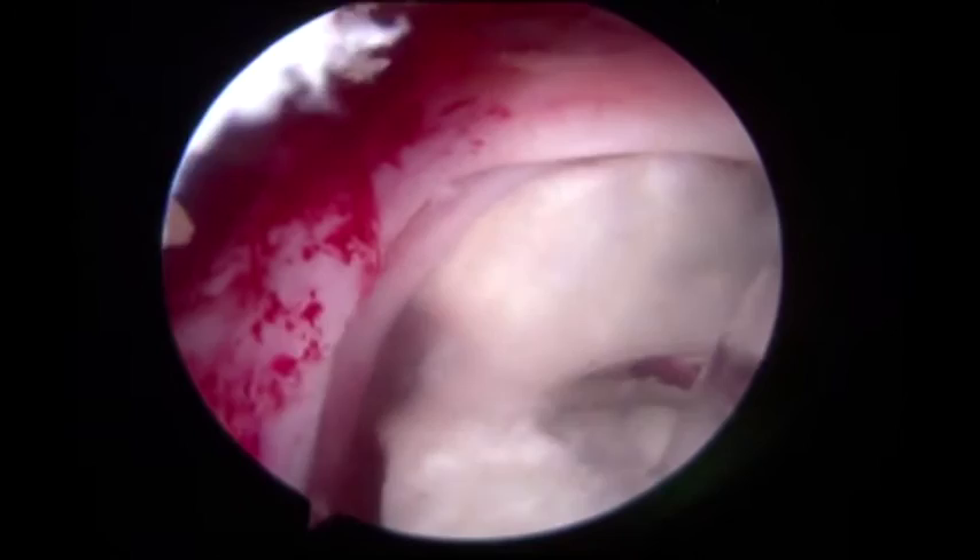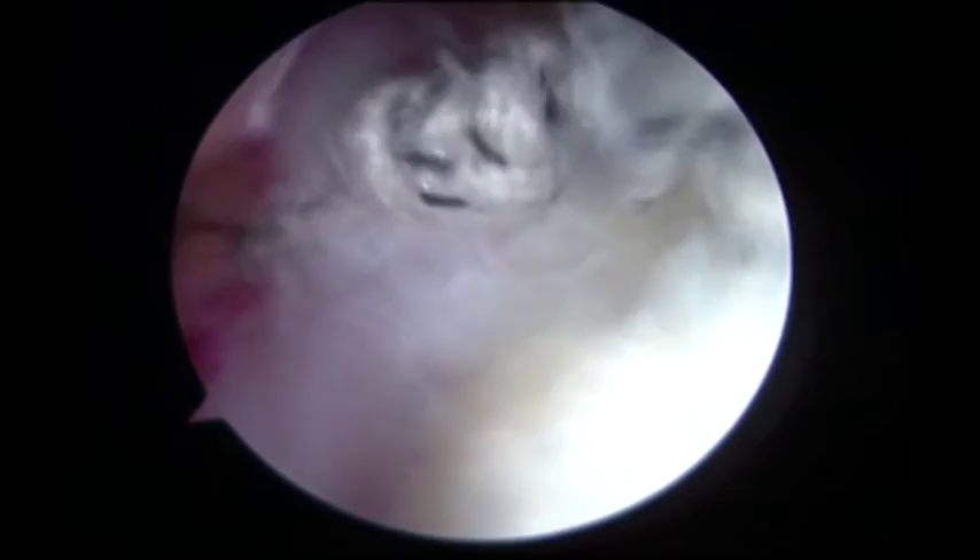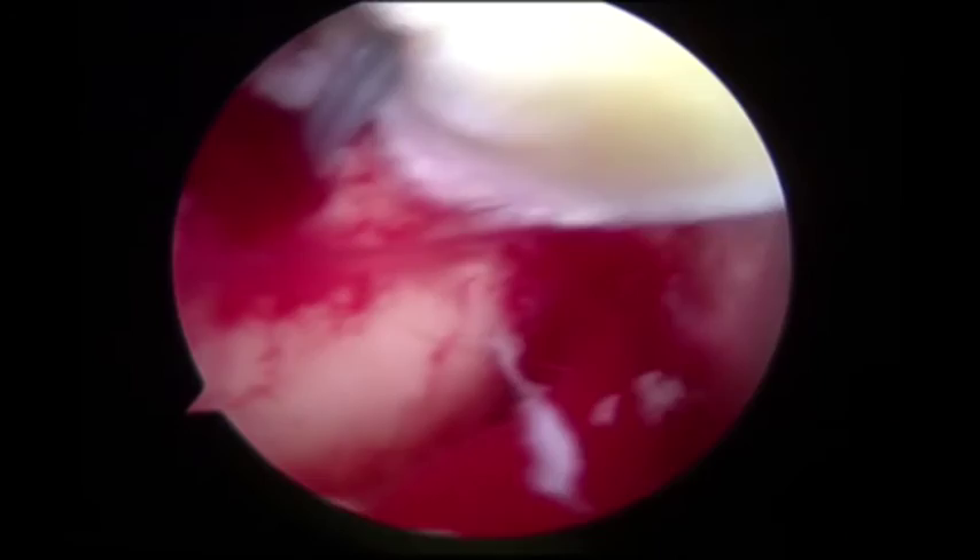Again, taking one of the sutures from the anterior anchor and one from the posterior anchor, creating a criss-cross effect. Viewing posterolaterally, the graft is seen and then attached to the remnant of the rotator cuff tendon with interrupted sutures, utilizing a suture-passing device.